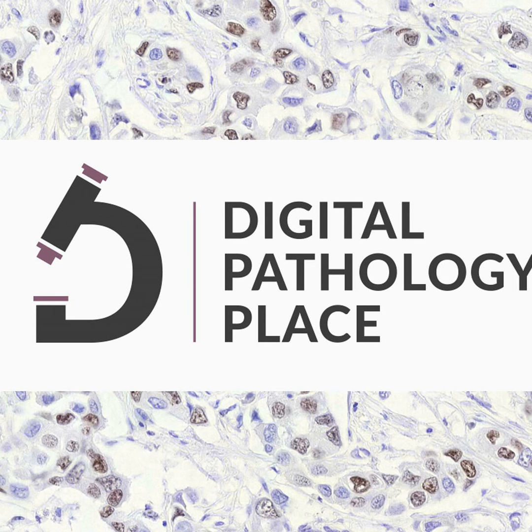So first of all, you know that there is, let's say within brackets, a war in digital pathology over the image format. Each scanner vendor has their own for a specific reason. I will not take any position on any format, but there is a reason behind them. Some are targeting only the hospitals, where they claim it will take some seconds to have an image scanned. Some say, no, we are targeting research, so the scan will take 2 hours if necessary, but it will be the best image in the world.